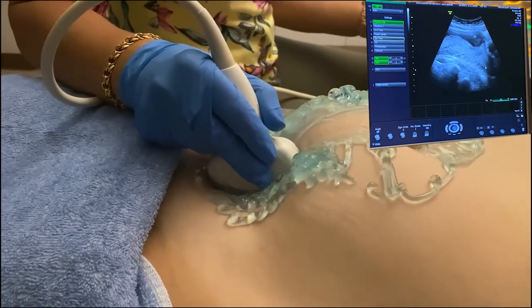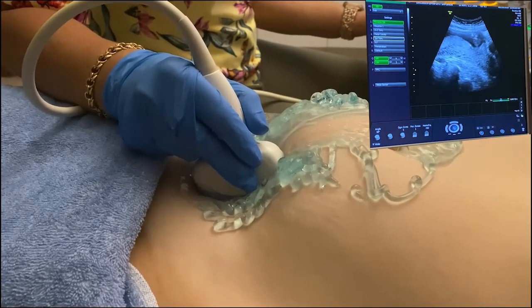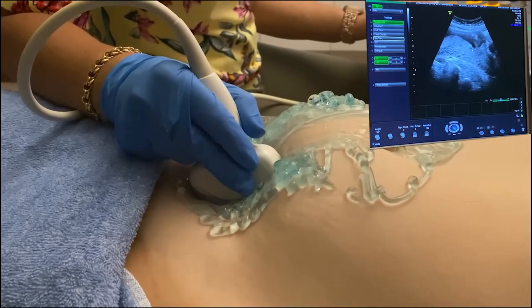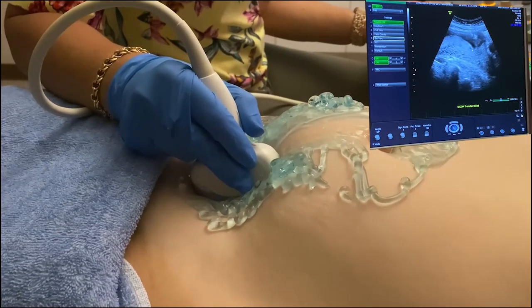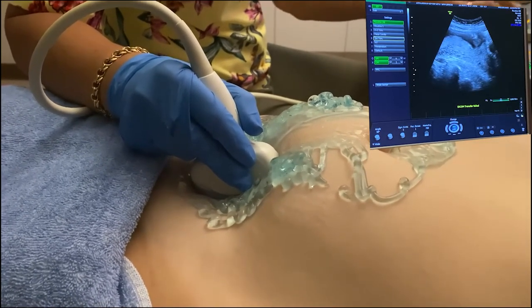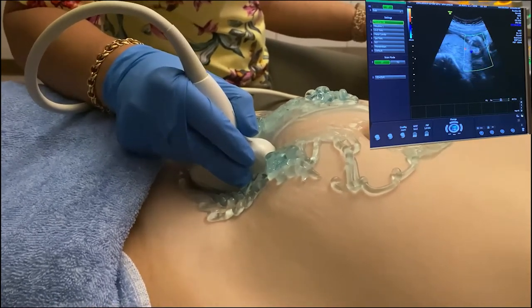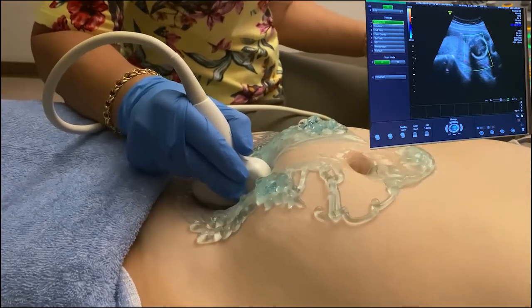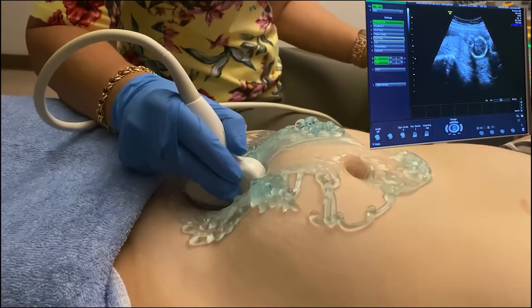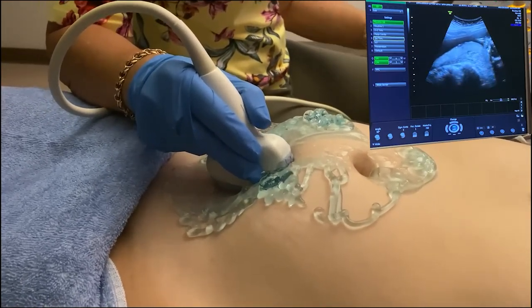And as you can see, I'm not moving my hand very much, but we can see that the tip of the placenta is away from the internal os of the cervix. We can confirm that there's no kind of vasa previa or anything just simply by putting our color Doppler on and making a quick sweep to make sure that there's no vasculature between the placenta and the cervix. I can further interrogate the placenta.